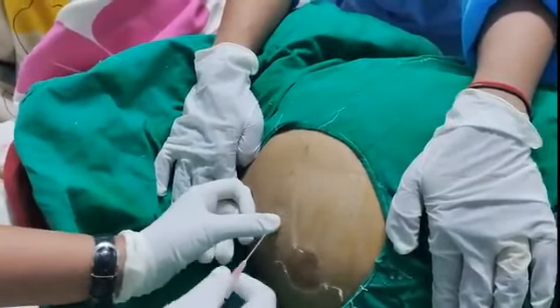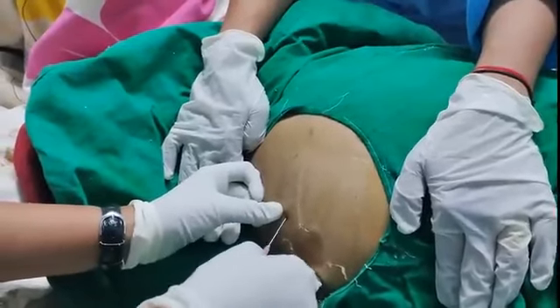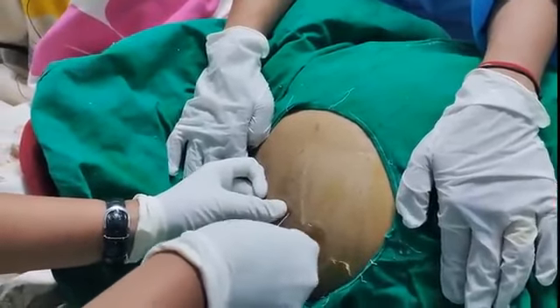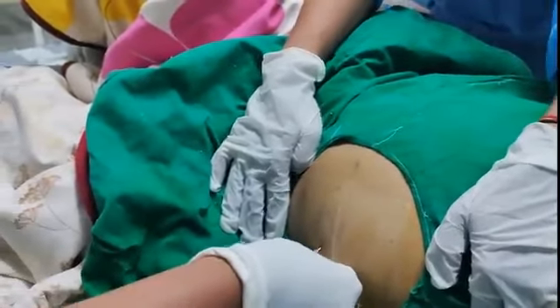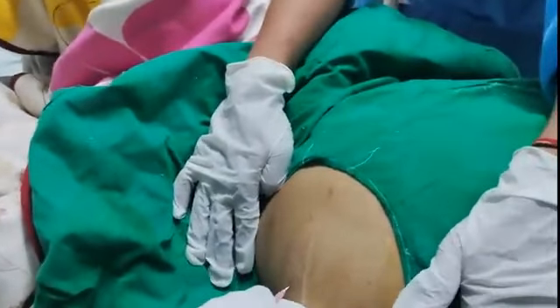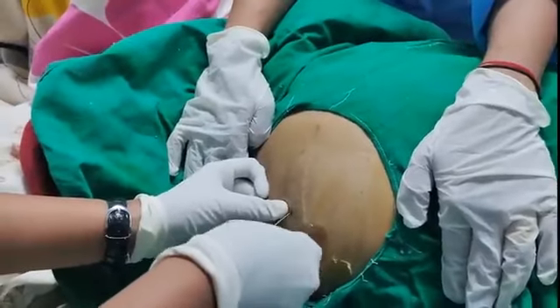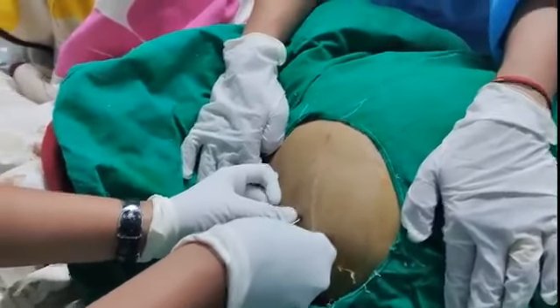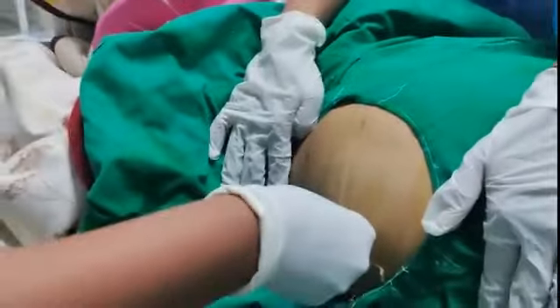Alternatively, insert the needle using the Z-track method, which can be done in several ways. One option, pull the skin, insert the needle perpendicularly, and maintain this skin traction until the needle enters the peritoneal cavity. Another option, puncture just the skin and pull it down, then advance into the peritoneal cavity. A third option, insert the needle at an angle, usually 45 degrees, to the skin and advance it.